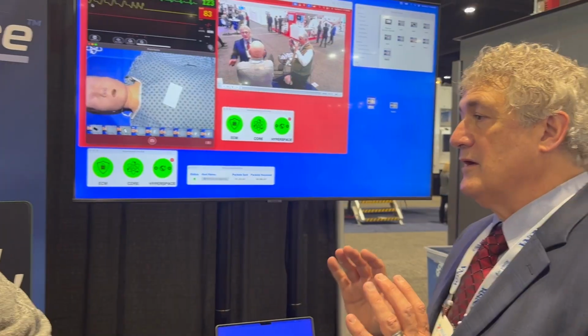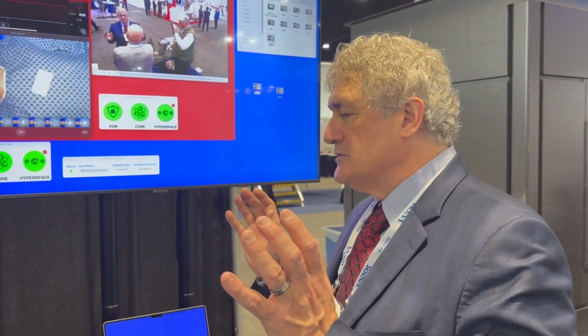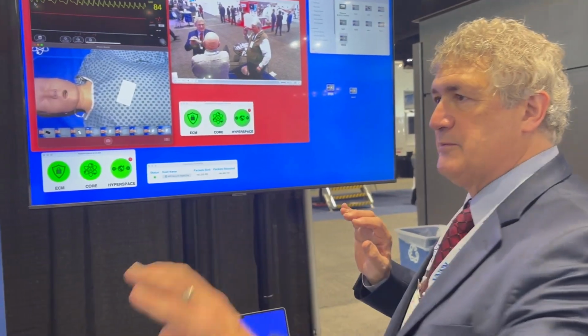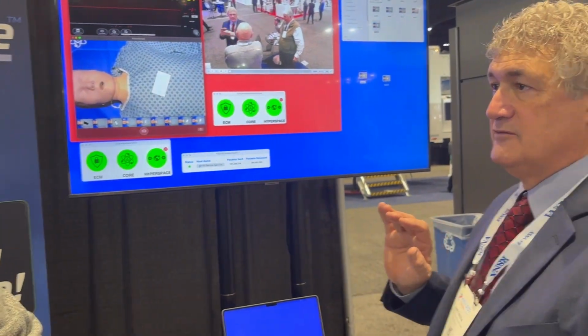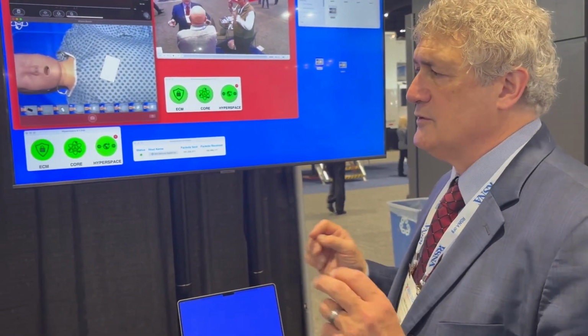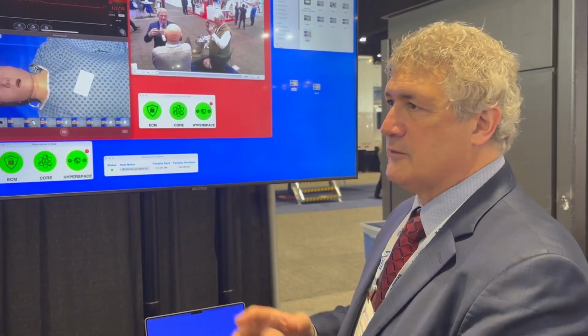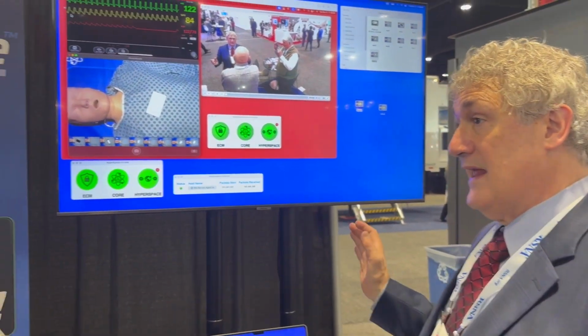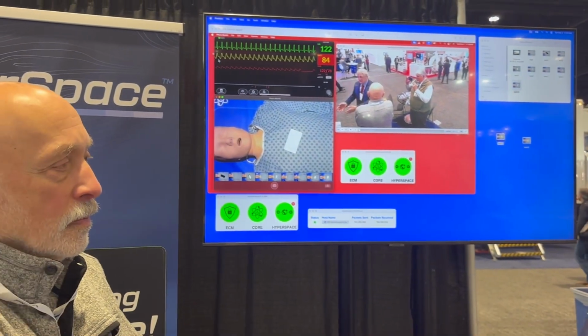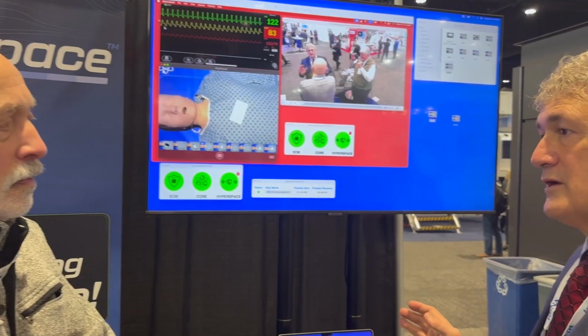Well, we have a protocol that allows for the encryption to be able to stuff packets together inside the transport in such a way that the communication is very, very efficient. We also have the encryption occurring on each of the devices. So it's a very minimal load in order to be able to do that encryption. We don't have one system that has to have a supercomputer in it to be able to handle all the encryption for all the devices. We distribute that out so that every single remote device and every single server does a little bit of the work. Therefore, the amount of work that has to be done is minimal.